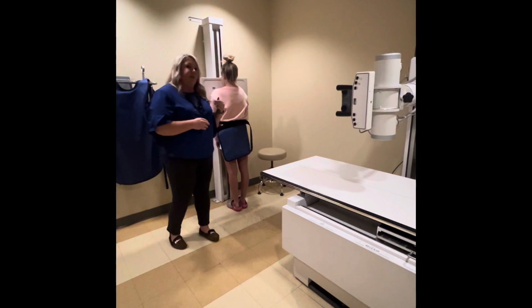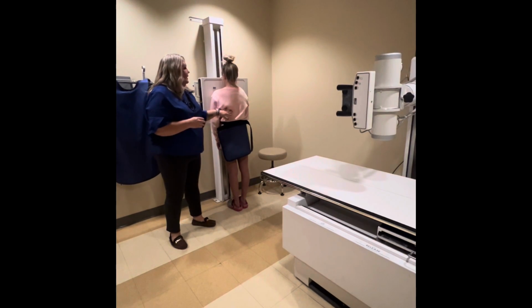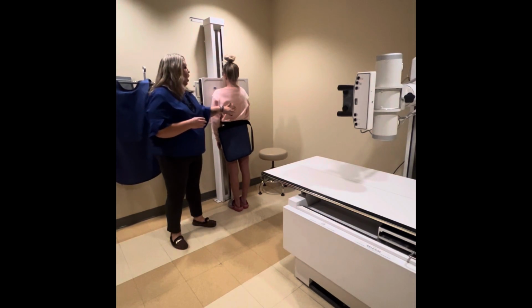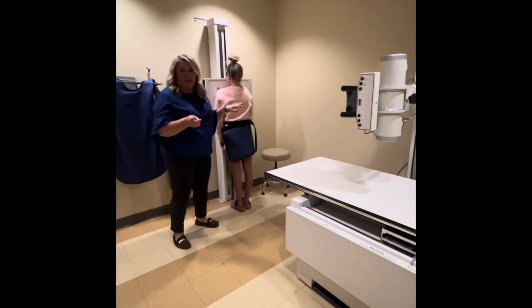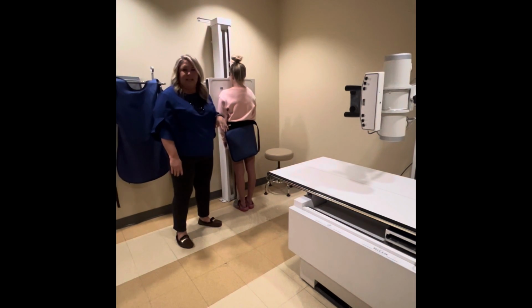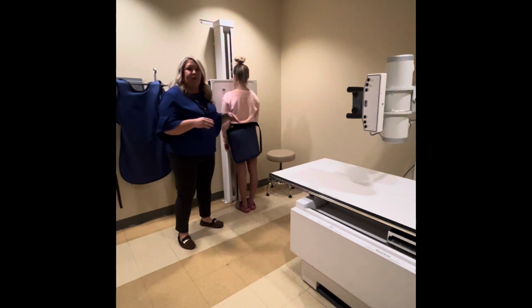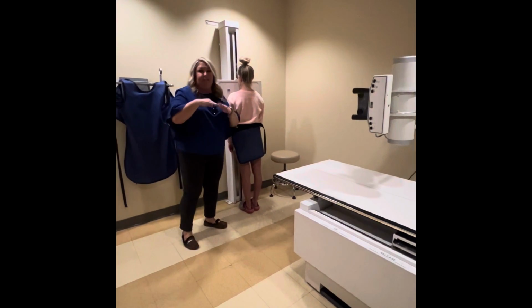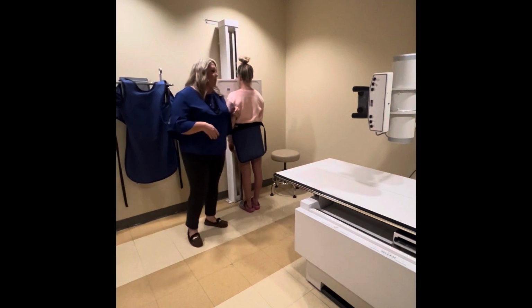Watch your patient so that you can make sure that they're doing what you're telling them to do. Take another great big deep breath in and hold it, and then you would shoot your exposure. Make sure you tell your patient to breathe, and you can breathe and relax. So that's what we have for a PA chest x-ray. The reason why we want her to take that big breath in is because that depresses the diaphragm, so that doesn't obscure the base of the lungs.